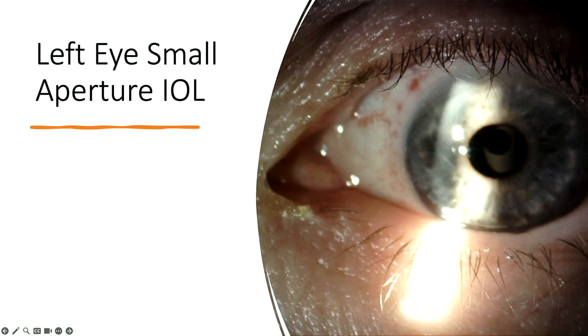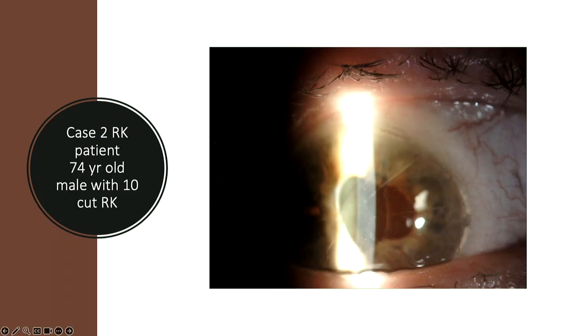For the left eye in this patient, I chose the small aperture IOL. You could see what the post-op photo looks like, and she did quite well.